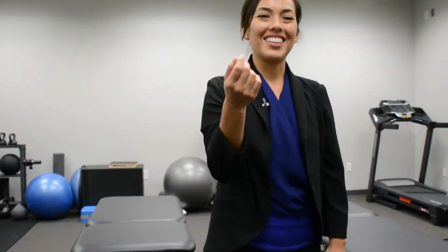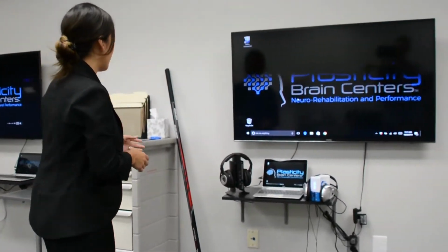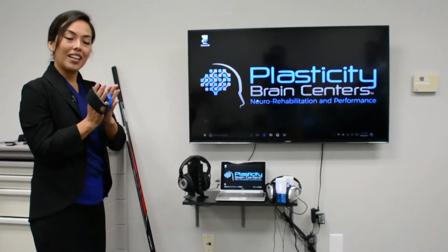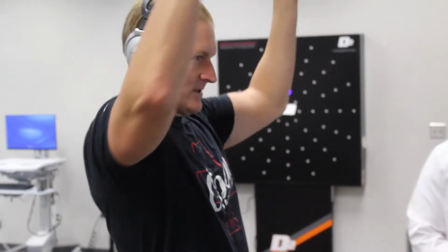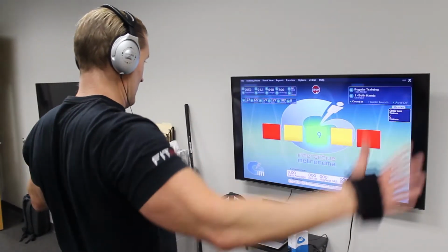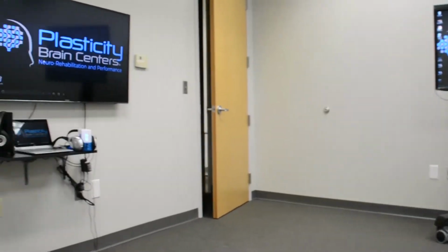We have several pieces of equipment here that also assist with therapy. Over to your left, we have the interactive metronome. This assists the patients with timing and precision, so they'll use a clicker, right? But it will be, as I mentioned, customized to every single person. Sometimes they'll combine weights, sometimes they'll combine balance plates, so it all really depends on not just what part of the brain they wish to stimulate, but how they want to stimulate it.